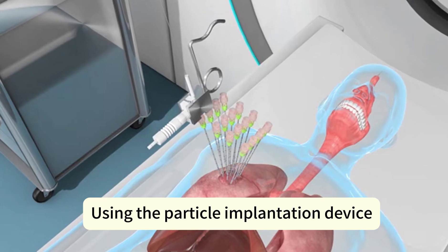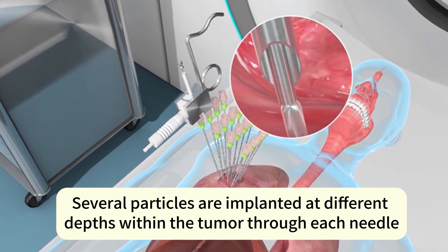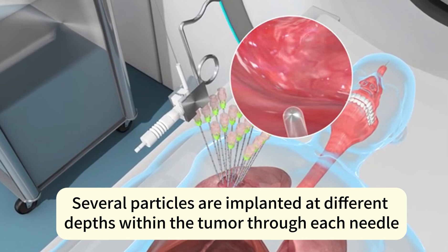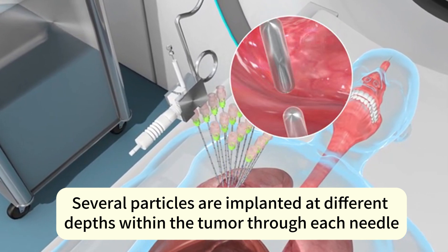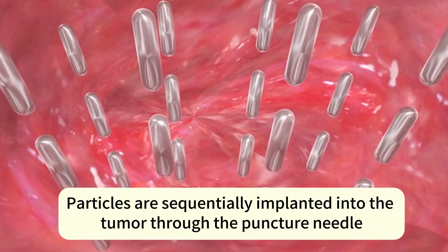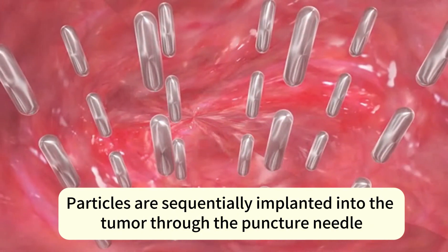Using the particle implantation device, several particles are implanted at different depths within the tumor through each needle. Particles are sequentially implanted into the tumor through the puncture needle.